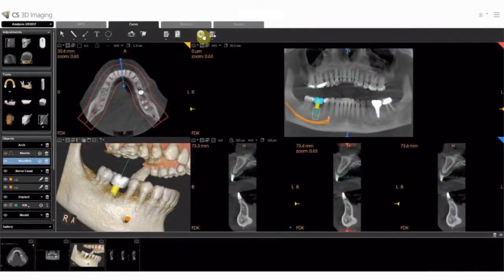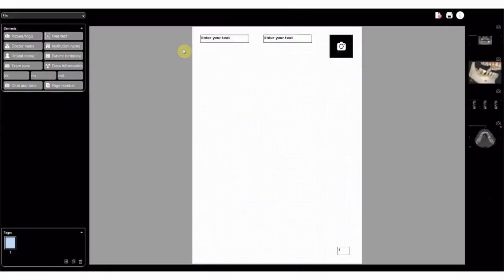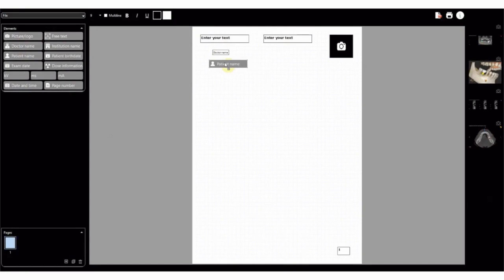In addition to the film composer, a new report editor has been designed to give the dentist an easy, flexible, and quick way to create templates and produce reports. The user adds text, images, and DICOM information boxes, then saves the page as a template.